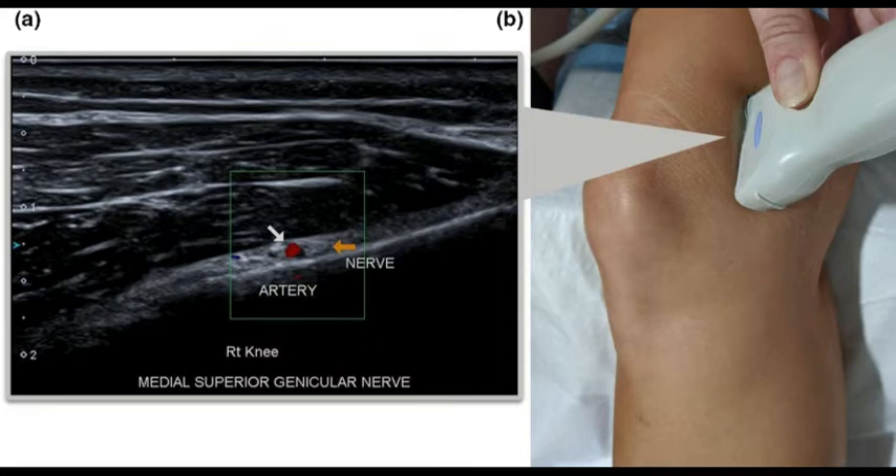In this image you can see the superomedial genicular nerve approach. We are using a linear high-frequency probe. You can see the femur, the vastus medialis muscle, and the pulsatile genicular artery. Very near to that artery is the genicular nerve.